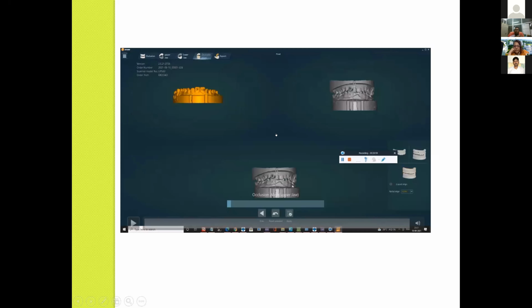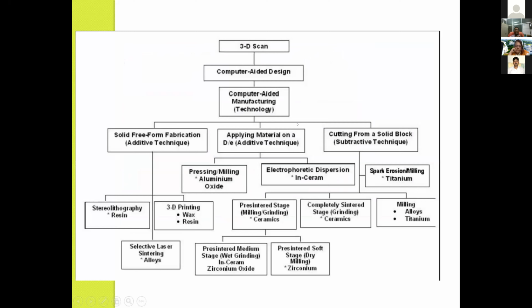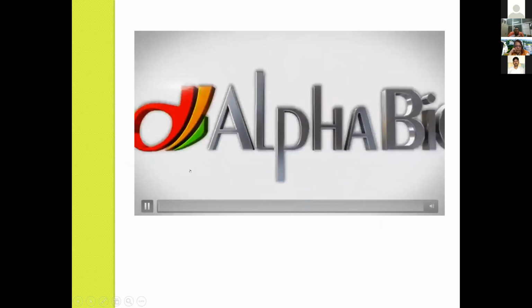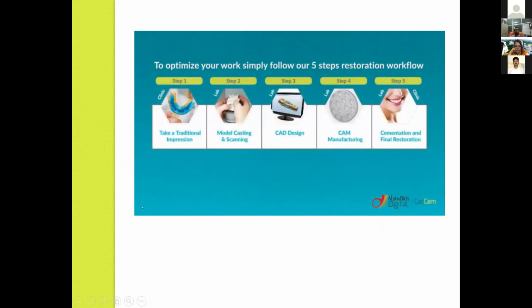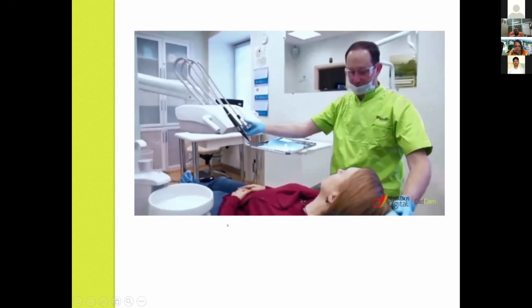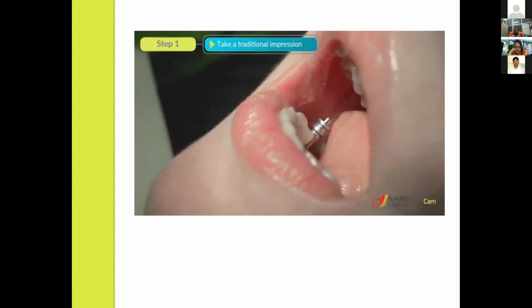Dr. Sumit has given some photographs directly from the laboratory. I am not much of an expert in getting all these things. I think I have one more video. I think it should skip. They are using intraoral, or it is useful.